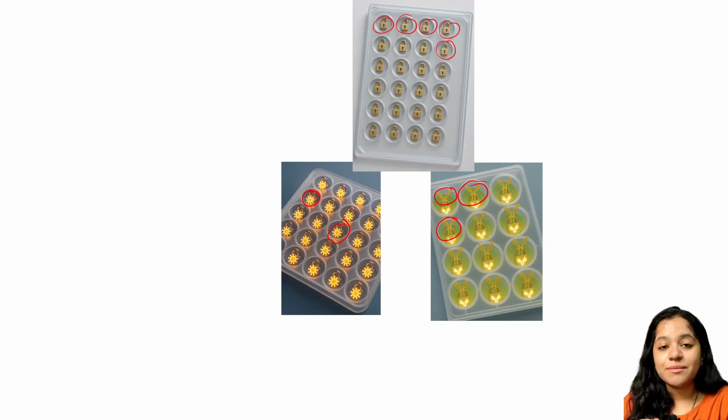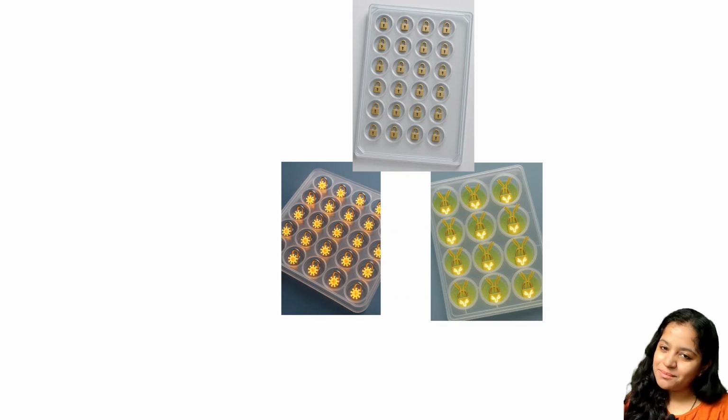ये धुलने के भी बाद नहीं जाएगा because of adsorption. It gets adsorbed on the surface of the wells. Okay. Now understand, absorption का मतलब होता है समा जाना, adsorption का मतलब होता है to get stuck on the surface. Okay. That is adsorption. So here we have adsorption. Clear? This is known as immunosorbent material.